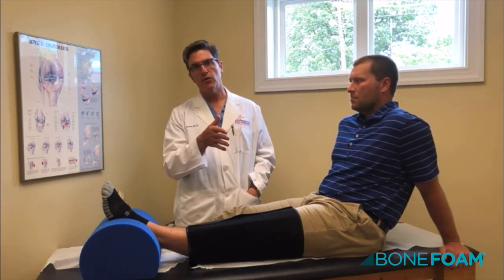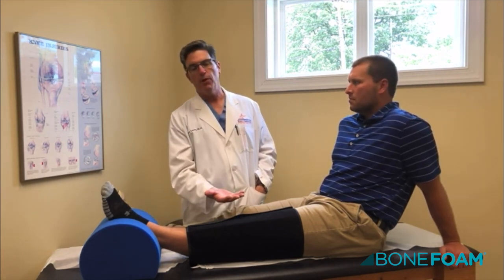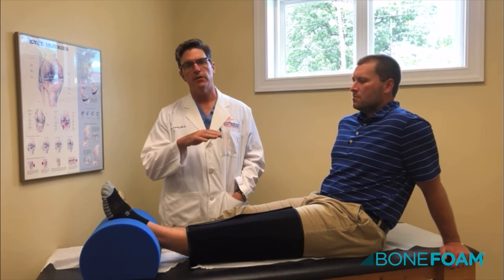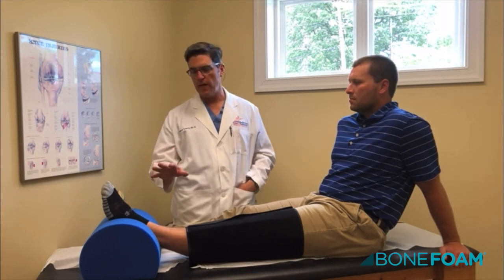In the CPM we went up to 90 degrees of bending or flexion; we're now at zero degrees. It would be much more comfortable to have a pillow under the knee and be a little bit flexed, but the number one complication of a knee replacement is the inability to straighten one's leg, causing you to walk with a limp — so this was designed specifically to eliminate that.